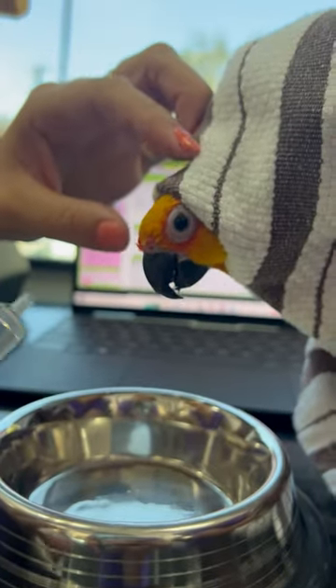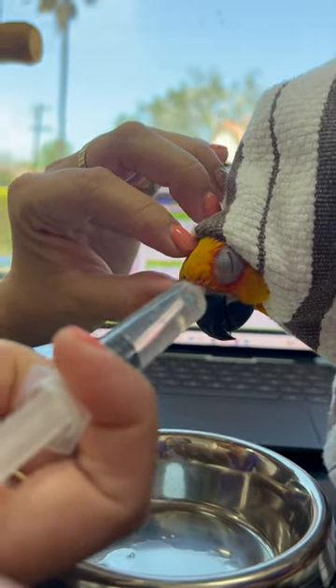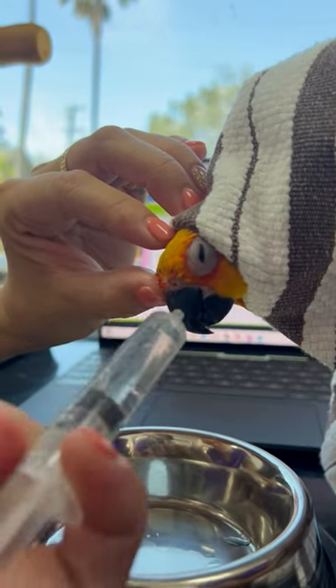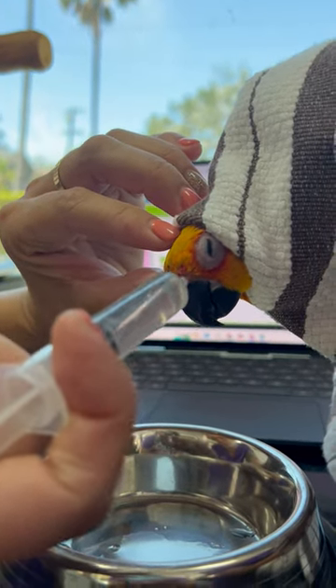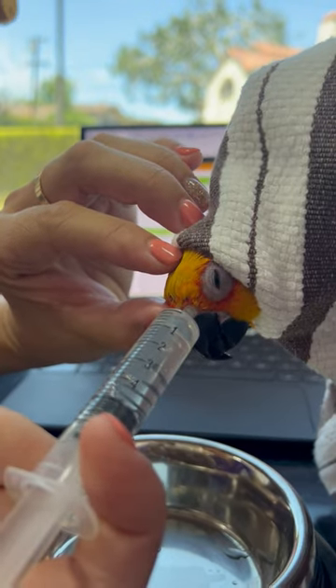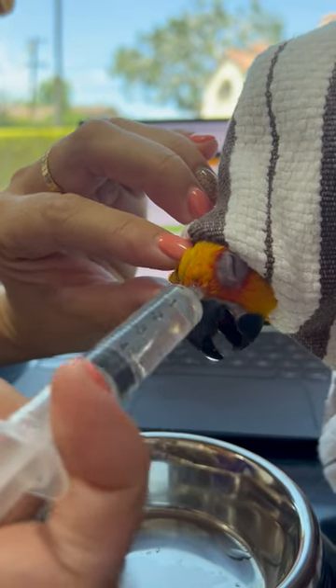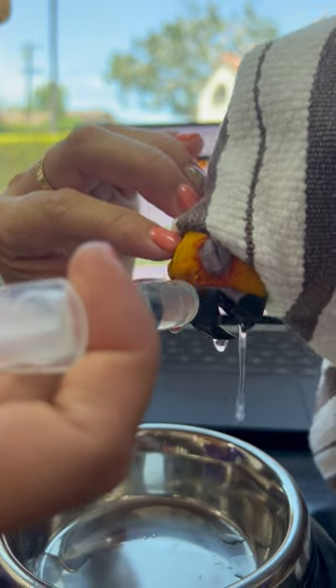Now, to flush her sinuses, I'm going to flush about half of this, like one mil at a time, line it up with her nare, or her nostril. I have the syringe over her left nostril, I'm plugging up the right nostril with my thumb, and then I'm just going to quickly pulse in some saline.